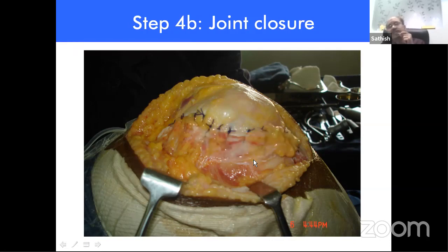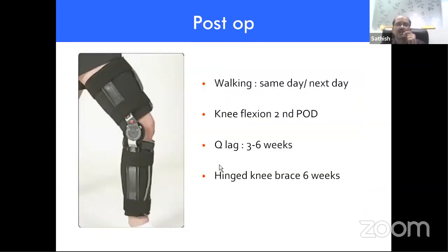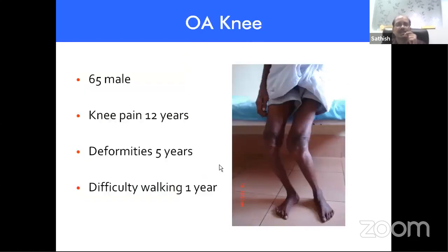If you have done a single arthrotomy, like you do a lateral retinacular release from the medial side, like a single incision, this area will have a gap. Now, because we have done it as an expansile arthrotomy, what we call a coronal Z-plasty arthrotomy, we can close them. And we used to give this patient hinge knee braces for 6 weeks to avoid inadvertent sudden knee flexion, because the quadriceps snip repair has been done. But most of the patients can walk on the first or second day.